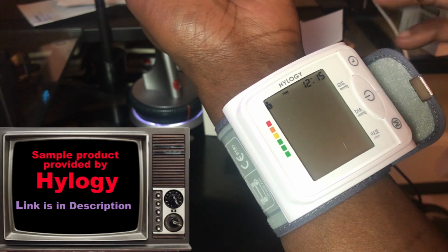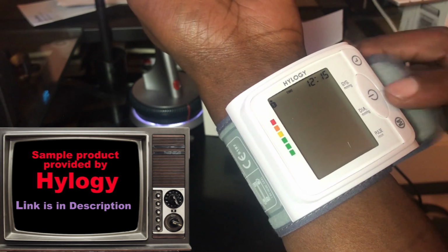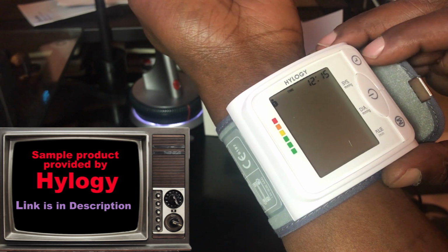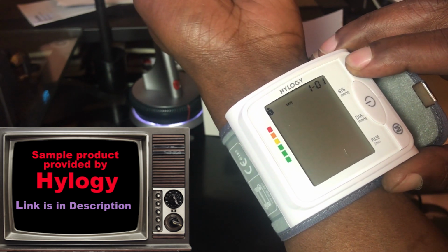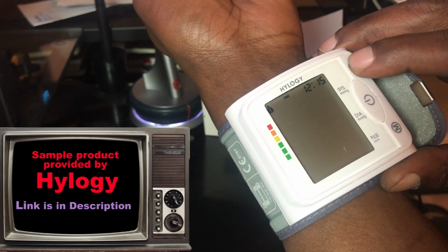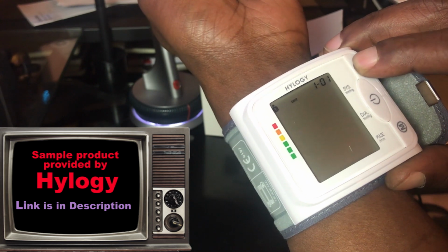To select the user, so this can be used between 2 people. Say for example me and my partner are using the same machine. So you press the power button for 3 seconds. 1, 2, 3. Let's do that again. 1, 2, 3. And then the user starts to blink.